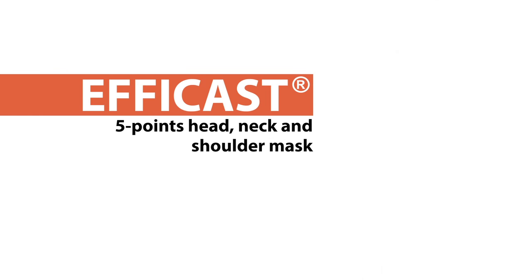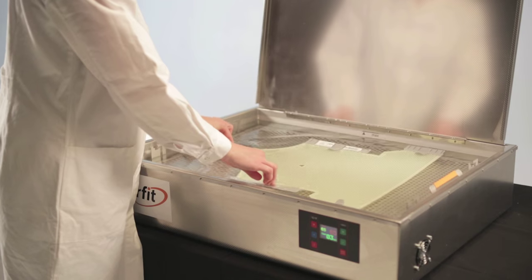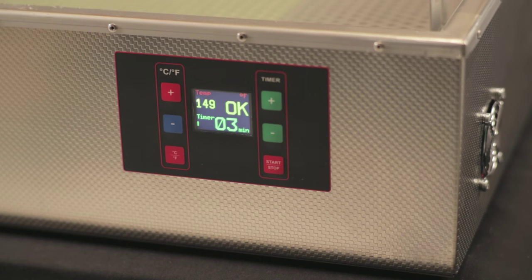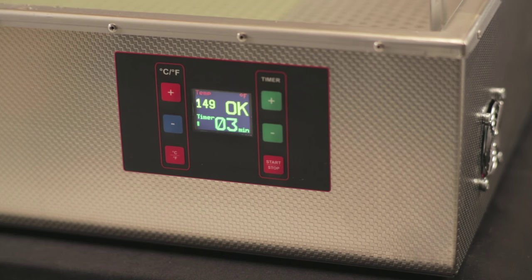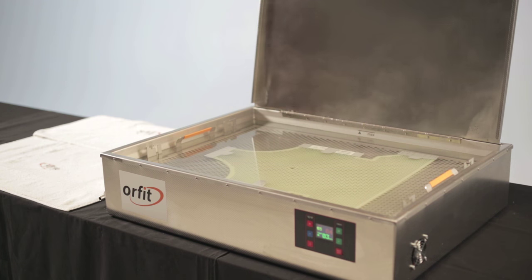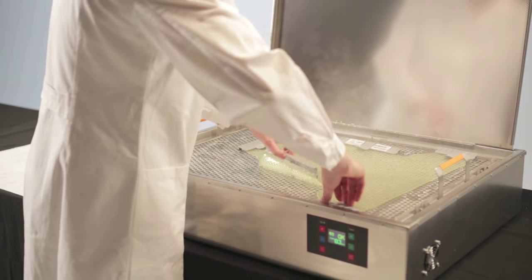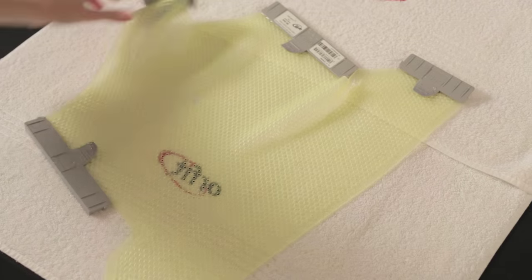Five-point head, neck and shoulders immobilization mask. Place the pre-cut mask in the hot water. Make sure the temperature is between 149 and 158 degrees Fahrenheit. Leave the mask in the water for at least three minutes for a single-layer mask and four minutes for a hybrid mask. Take out the mask and remove excess water with a towel to avoid hot water from dripping on the patient.